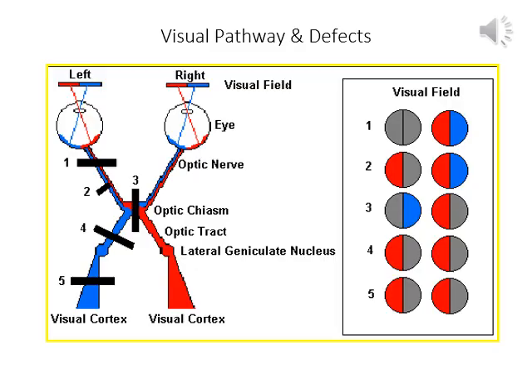When we talk about hemifield interpretation, we often see a figure that looks like this, which summarizes the different defects that can happen in the visual pathway and the pattern of results that would be observed. And so we're going to walk through this figure slowly. What I want to point out is that we'll see there's a left eye and a right eye, and for each eye we see the visual field that's stimulated.